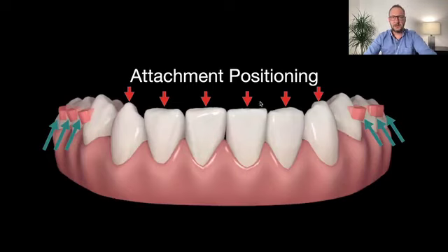So this is in another angle, okay? For the intrusion, we already have all the crown, the buccal surface, the lingual surface, the incisal edges, all working as a big attachment, okay? And here we inclinate the attachment, the surface down, so we can have the force being inserted against this wall here, so we can have more efficiency, okay?